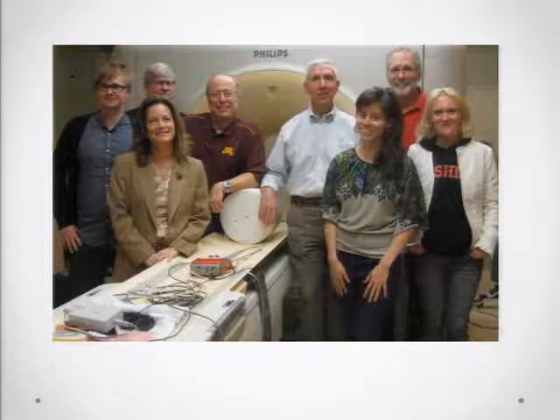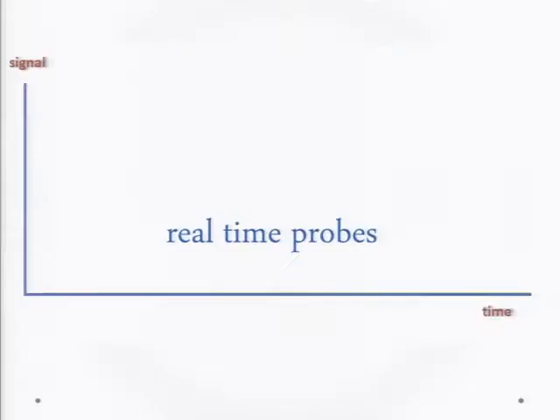And so as a result of this, we actually agreed that we were not going to recommend that the full phantom would be a part of a clinical diagnostic medical physicist's toolbox. Rather, we're in the process now of working with the vendors and having them make these H of L curves, and we'll end up suggesting that in the field you just use one module, which is actually lighter than the CTDI phantom that you're familiar with, instead.